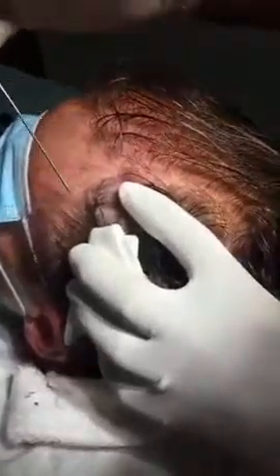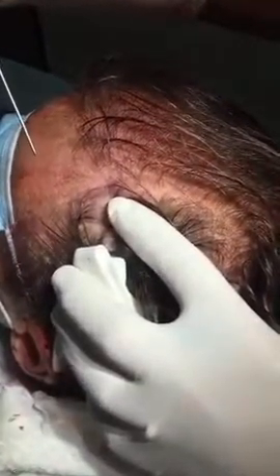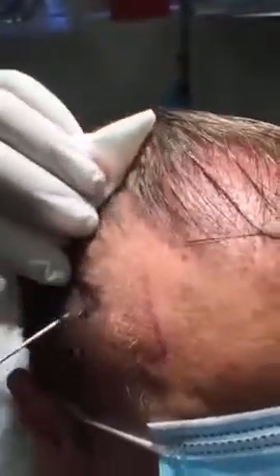We're making sites here. As you can see, the temples are both done. We made around 300 sites on each side, and this is the other side, another 300. Since he had a hairline and his hair is very fine, we didn't have to add singles. We put it behind the hairline, and we're going to put 2s here.